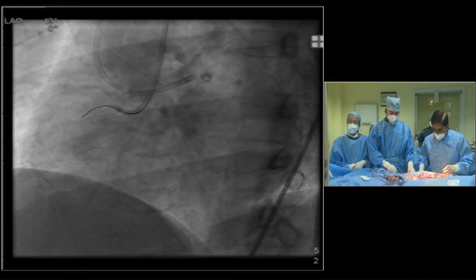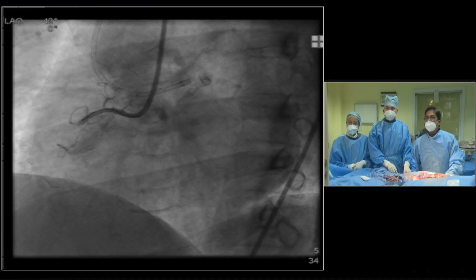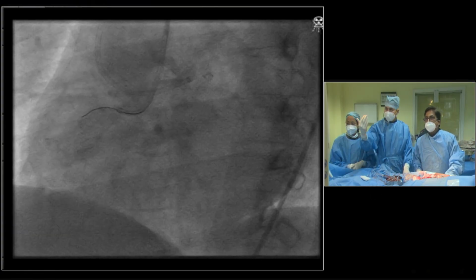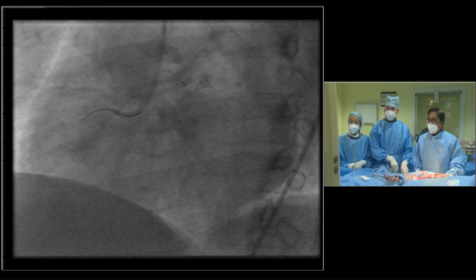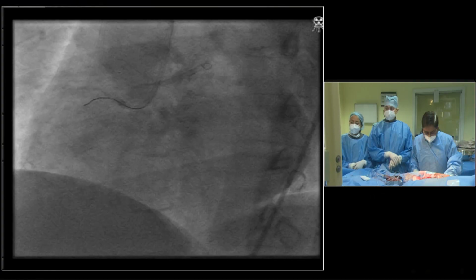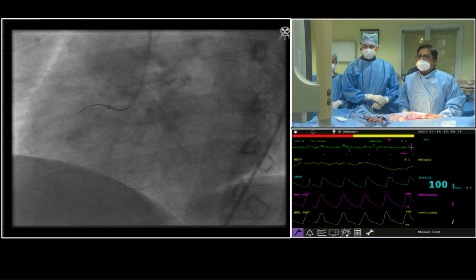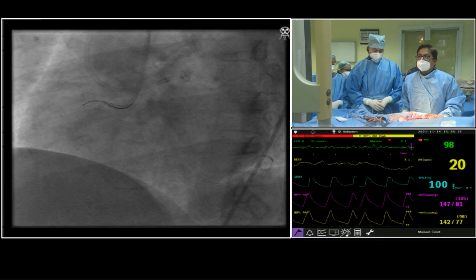Okay. So I will put the microcatheter there. And can I get this a little closer? So what is your wire escalation technique? What wire have you started off with? Well, I have right now only a Sion to get my microcatheter in place.